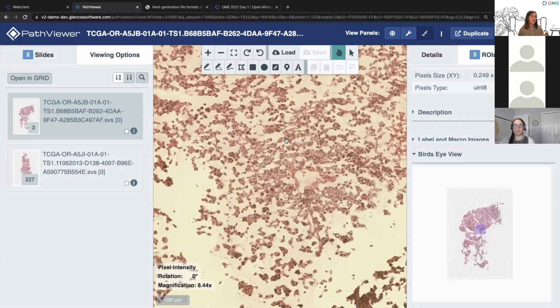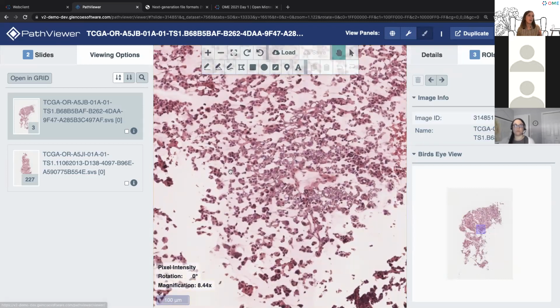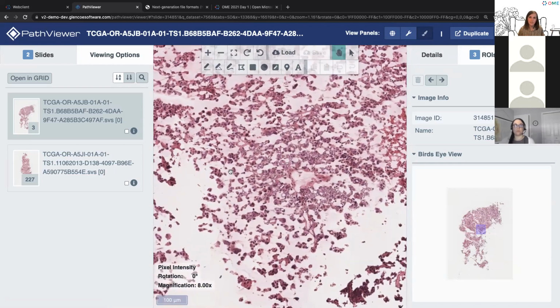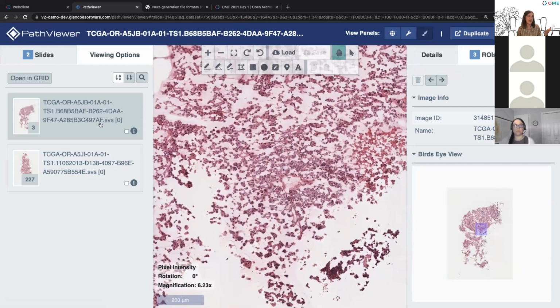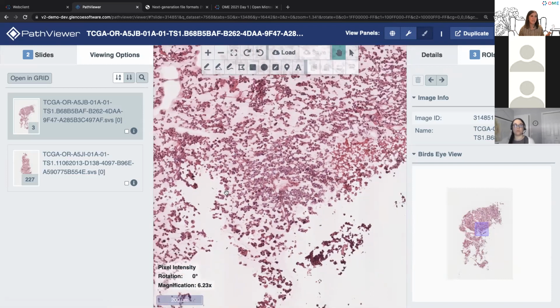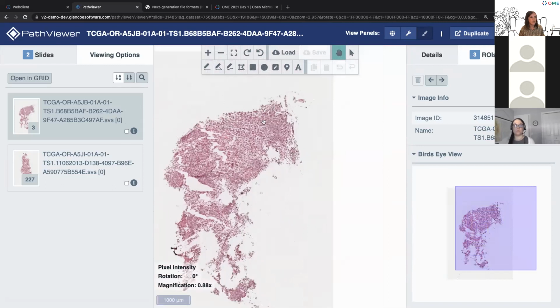And importantly, one of the things that will come up not only for this image data, but the derived segmentation data that we'll talk about, is that this image, either in its SVS form or in this OMERO specification, is quite large in X and Y, and therefore necessarily has a representation not only of image tiles, so a tile in this part of the image, a tile here. You can think of this as sort of at the acquisition level as well, how you acquire this image in tiles. But it also has a representation of multiple scales.